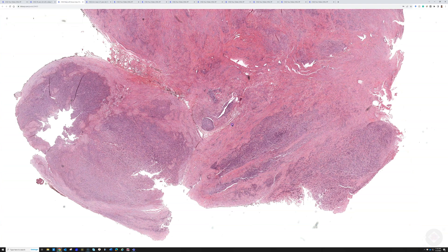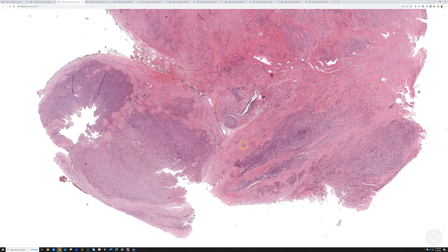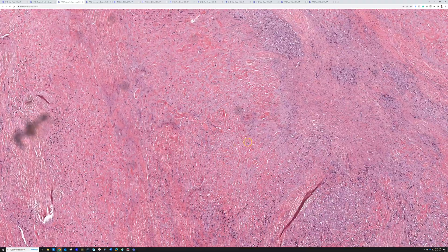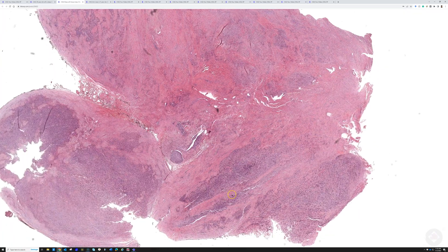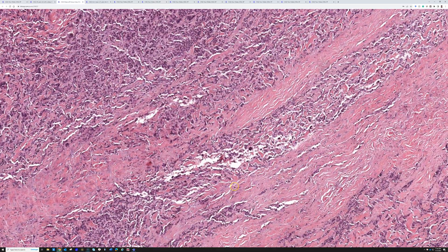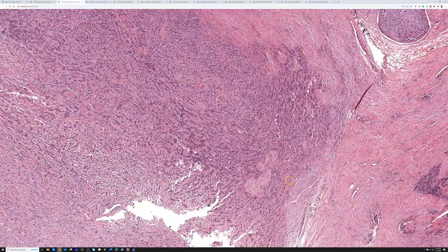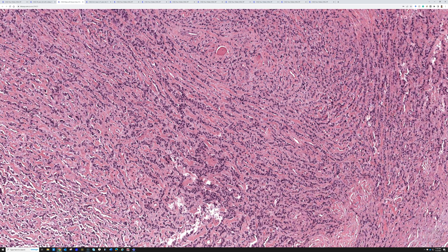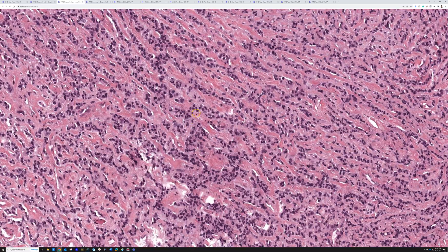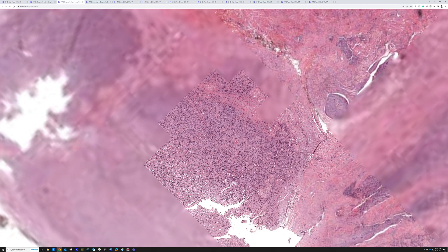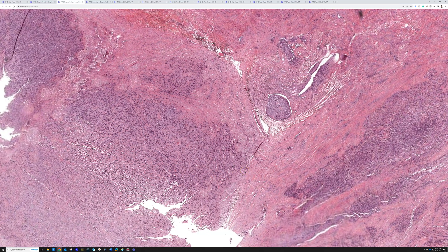Here's another example from a different patient — also sclerosing epithelioid fibrosarcoma. Again, that heterogeneity: cellular and then less cellular, sclerotic collagen background, and other areas with a myxoid background. Here we see more of a small round blue cell appearance, compared to the more epithelioid last example, but again with that unique cord-like pattern in a sclerotic collagen background. Sclerosing epithelioid fibrosarcoma is quite rare — I've only seen a handful of these in over a decade of practicing soft tissue pathology.